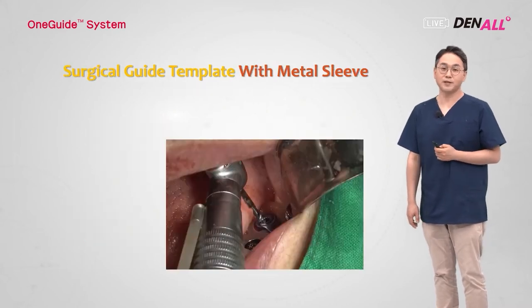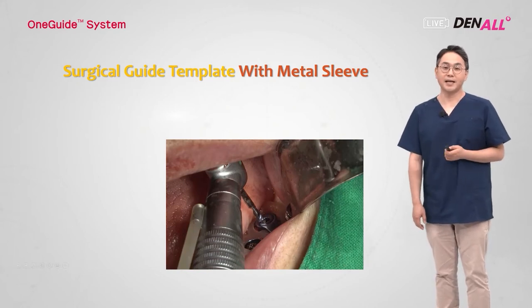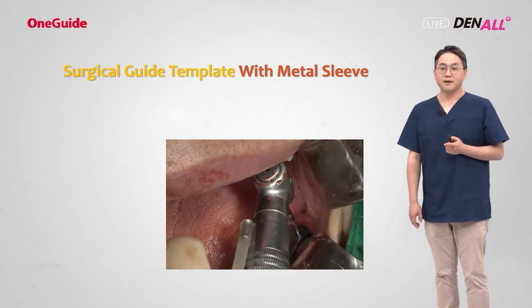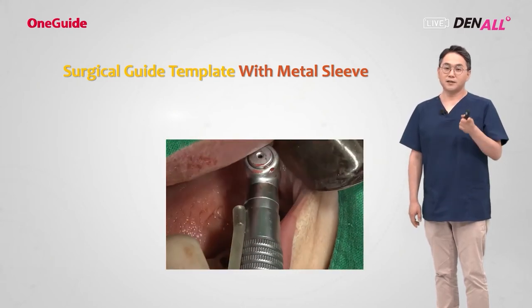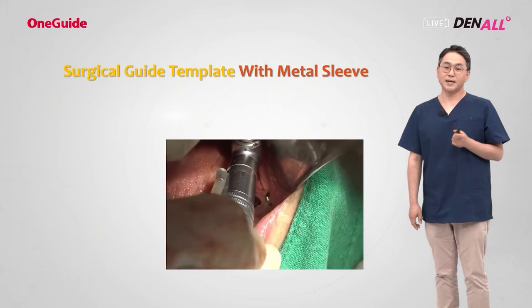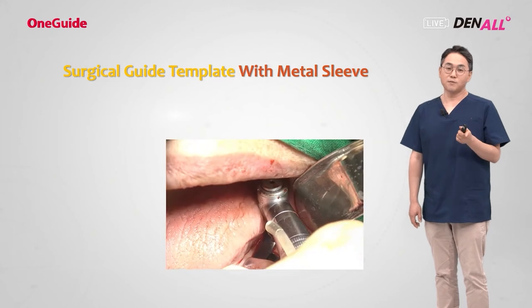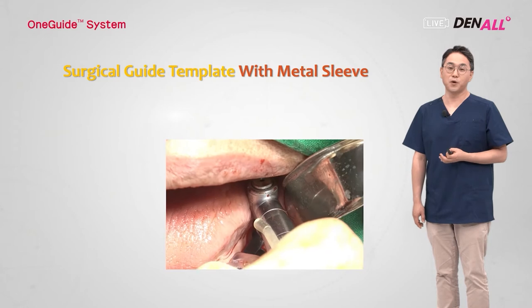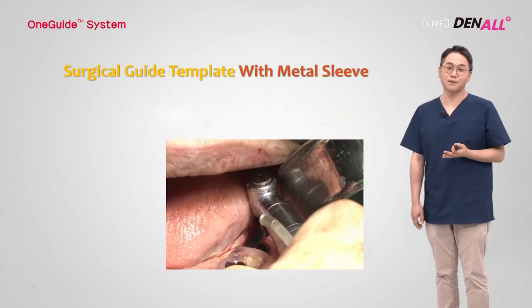This is another advantage. This is another company's digital surgical guide system with a metal sleeve. Let's look at the video. On the metal sleeve, even a drill key is attached to increase the accuracy of the 2.0 drill. The female patient in her 70s had a severe mouth opening problem. Only vertical access is allowed, so the patient is suffering. It's difficult for her to open the mouth, and a low speed of 50 RPM is recommended for the drill.